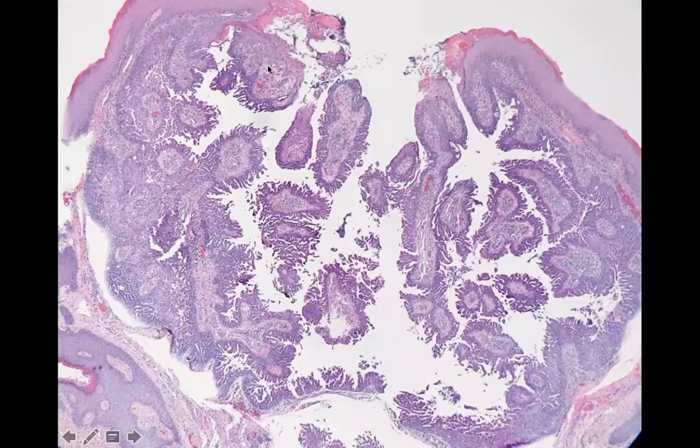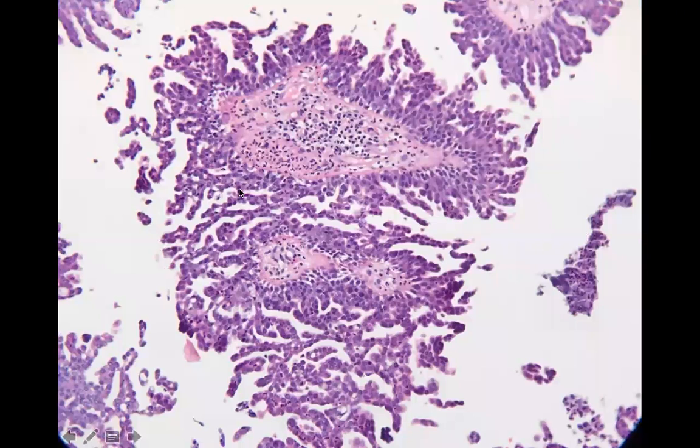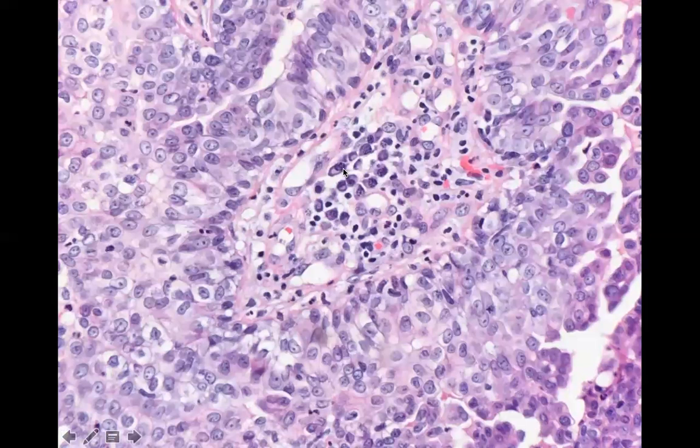So here, this thing, the ductal structures kind of go in and out as invaginations, and they have these little villus structures. And then the stroma is in between the epithelial extensions, okay? So anytime you see stuff like this, you're gonna have the phrase papilliferum in it. The little invaginations, and then here's the stroma, which is again pink hyalinized and vascular, but it's gonna also have a lot of plasma cells. See these little cells, little clock face, speckly nucleus off to the side, cute little plasma cells.